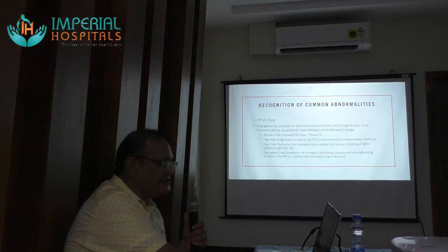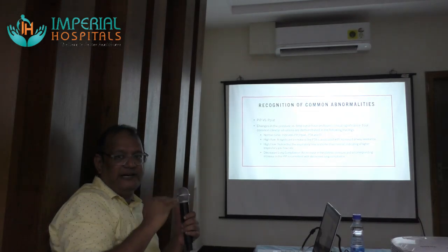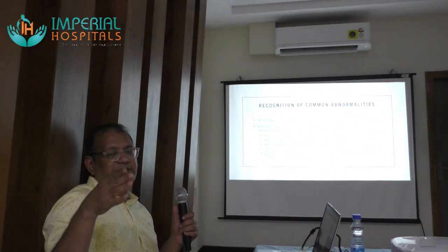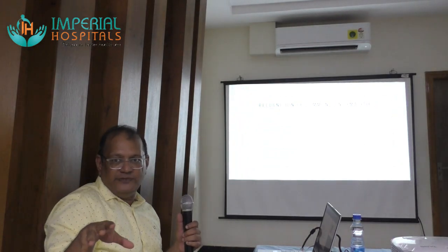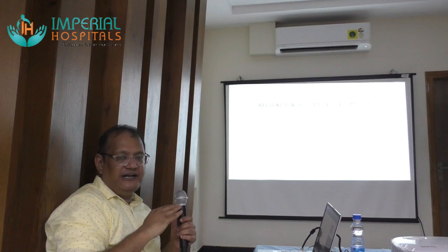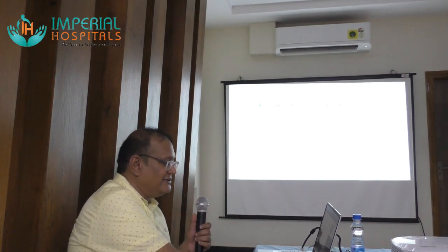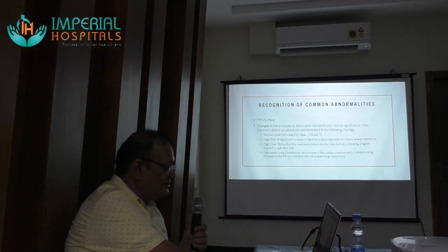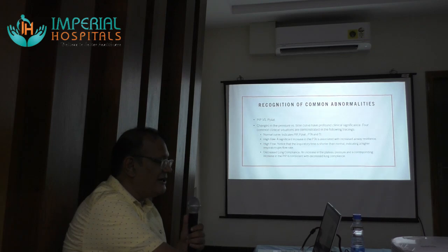High flow, you will notice that the inspiratory time is shorter. Expiration will start in a mechanical ventilator when the expiratory valve opens, right? But if the ventilator has already pushed the required tidal volume, inspiration will end there. So you'll see the inspiratory time is shorter than normal. And in cases of decreased lung compliance, you can see an increase in plateau pressure.